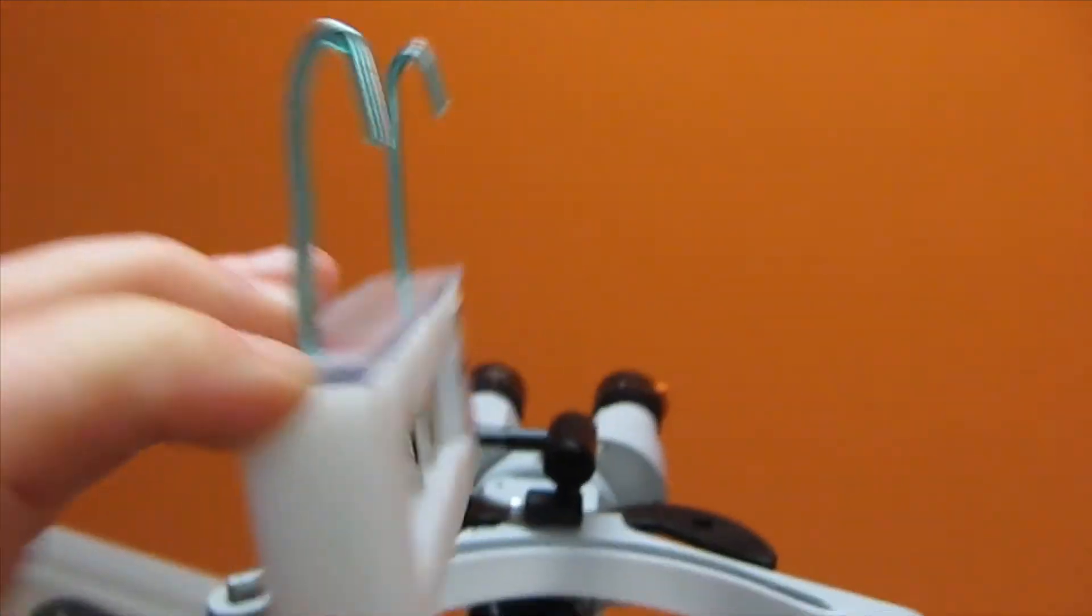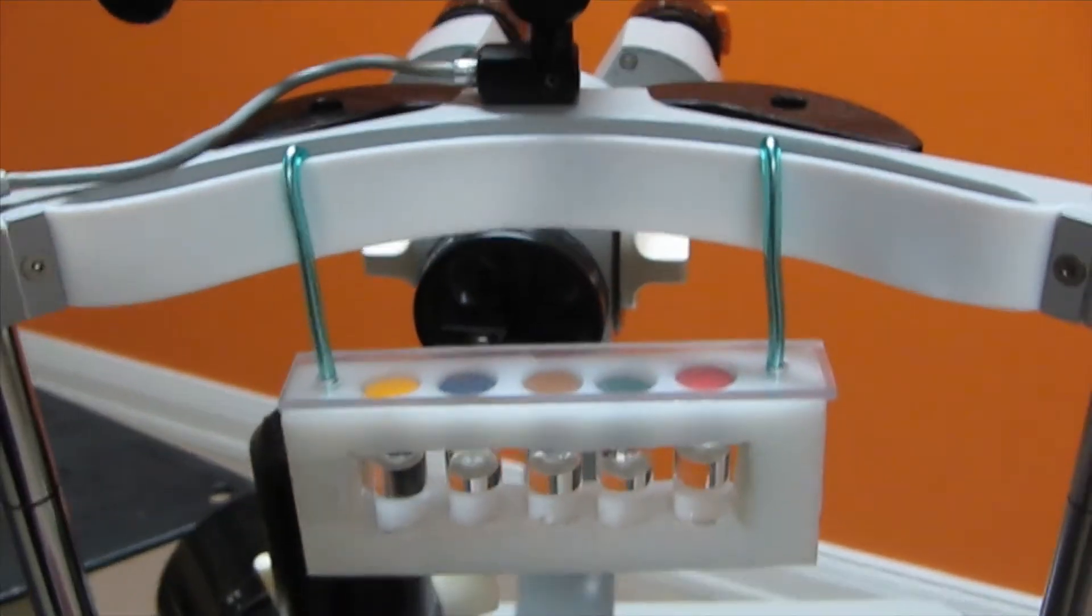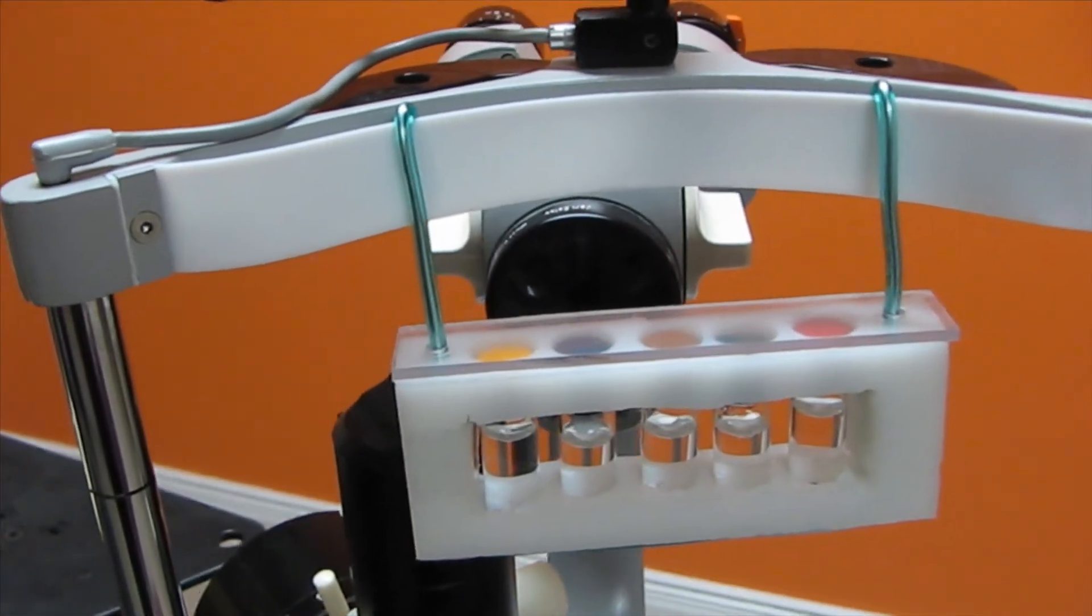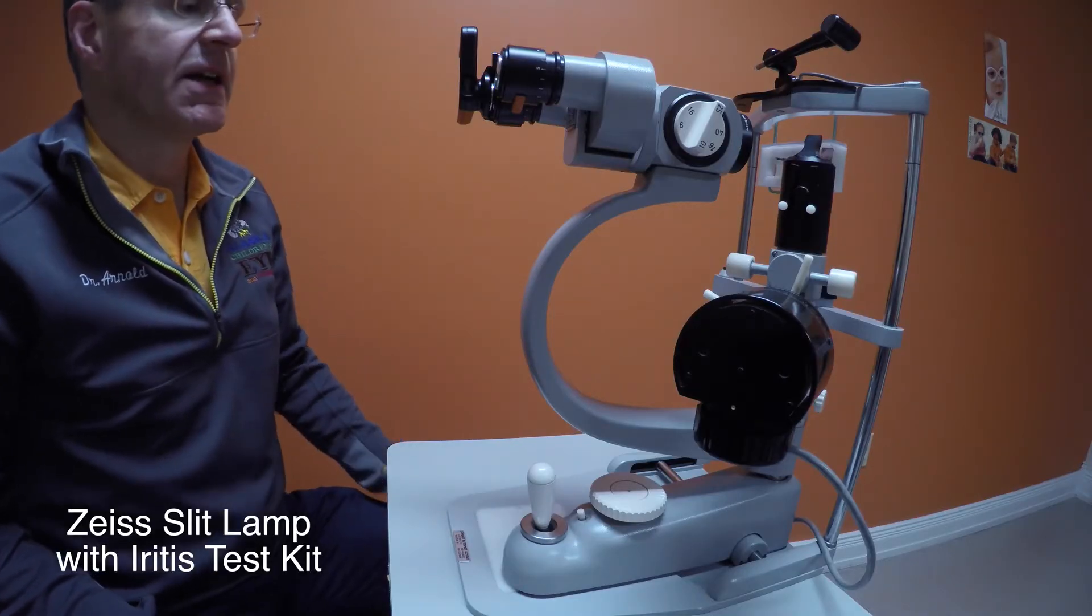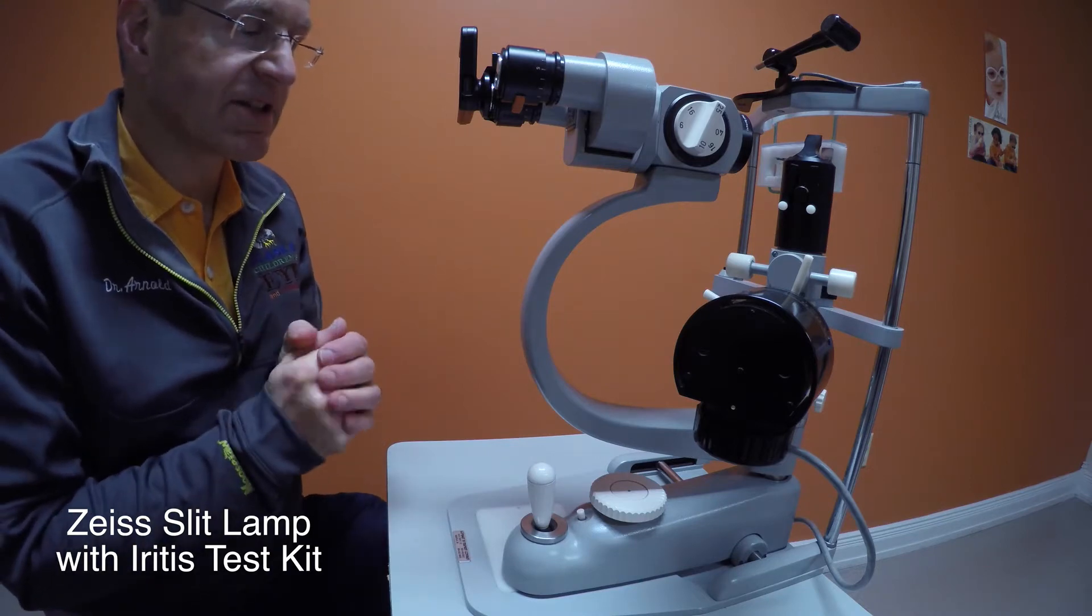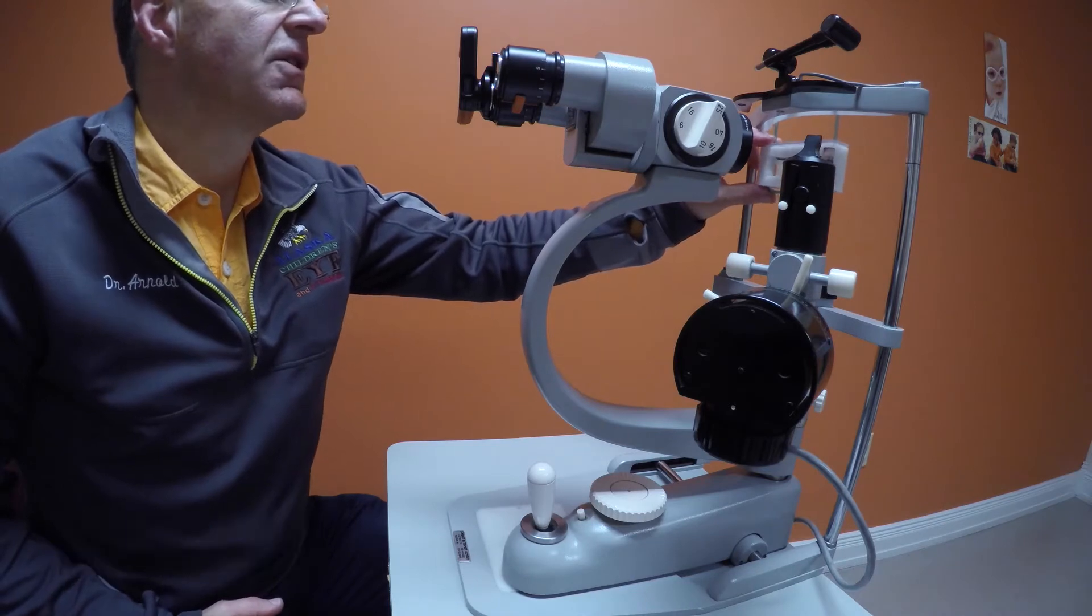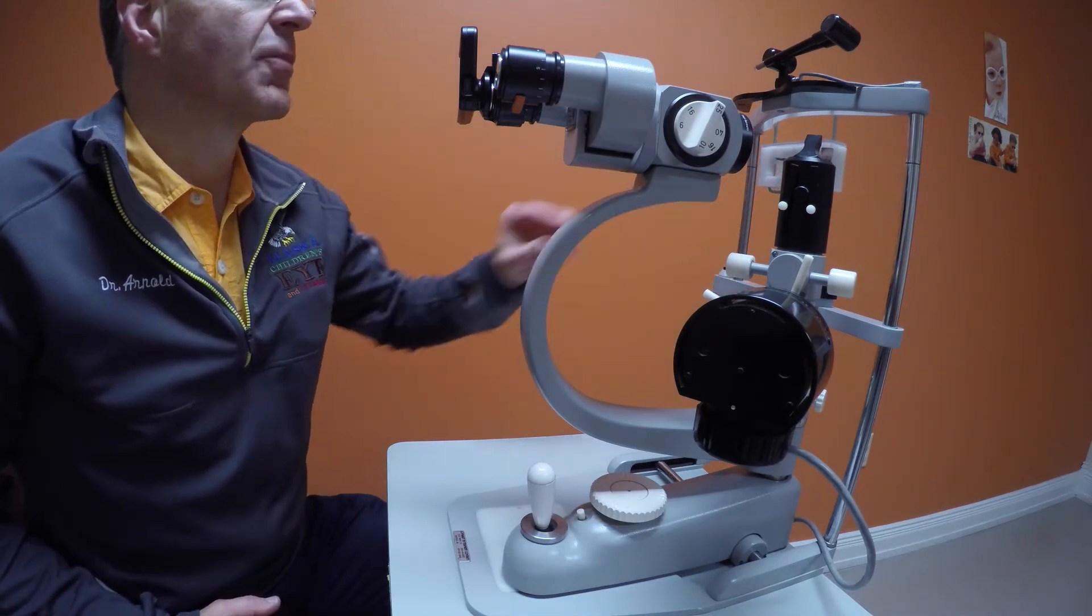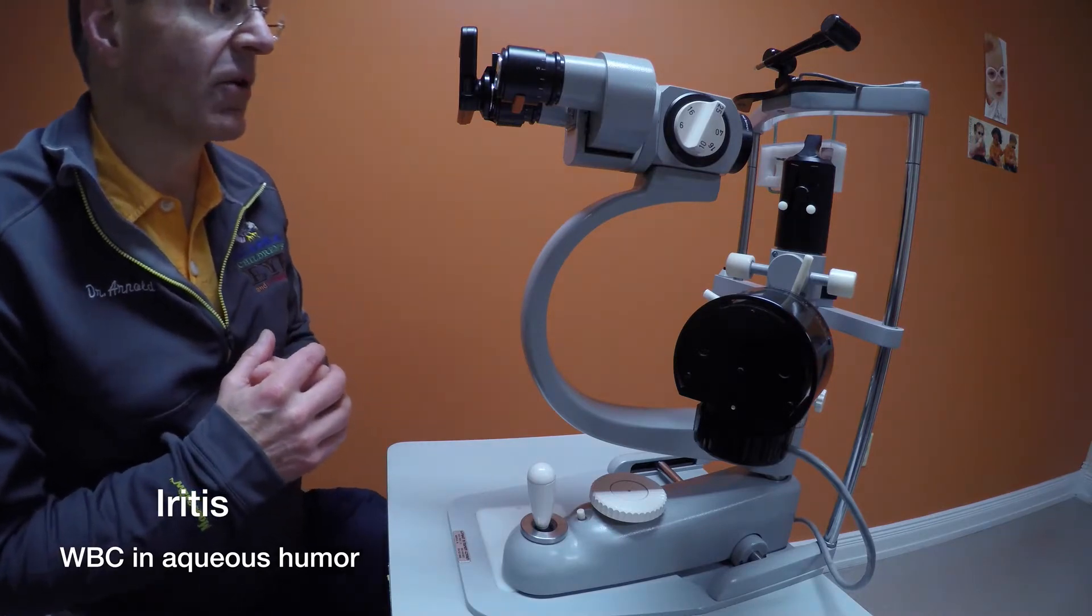The iritis test kit can easily be placed in the forehead mount. We're going to be demonstrating the Zeiss slit lamp and use of a Zeiss slit lamp with an iritis test kit to determine the presence or absence of white blood cells floating into the anterior chamber or iritis.